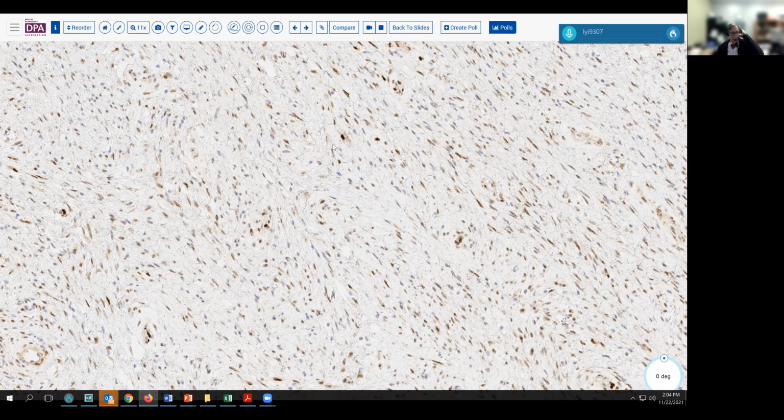raise that concern. Now, obviously with MPNST, you should not have an adjacent well-differentiated liposarcoma, and most of them are not retroperitoneal in location, but bearing in mind that nerves run through there, patients with neurofibromatosis can have retroperitoneal tumors. Yeah, you need to be aware of that issue. And in addition, in the endometrium, endometrial stromal sarcomas, some rhabdomyosarcomas, and some desmoid tumors can express MDM2. So bearing in mind those possible confounding issues, interpret your MDM2 stain cautiously.